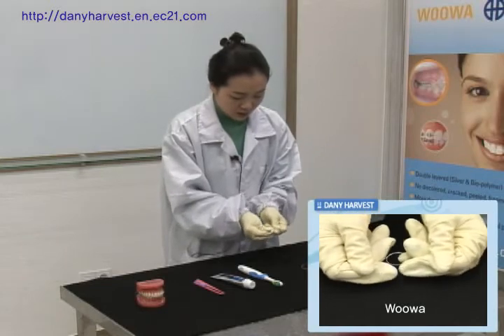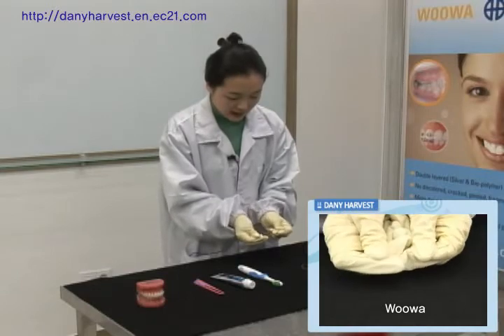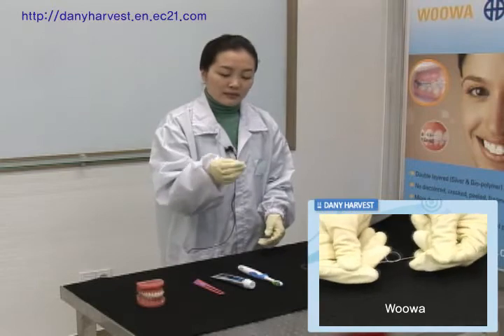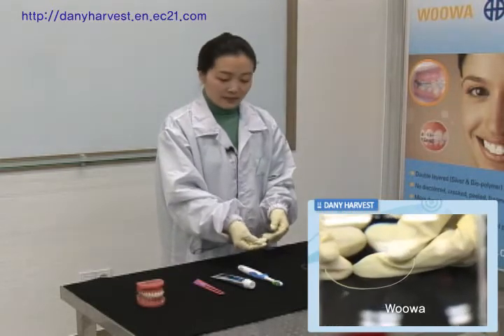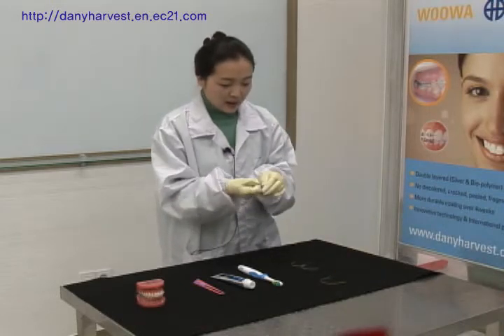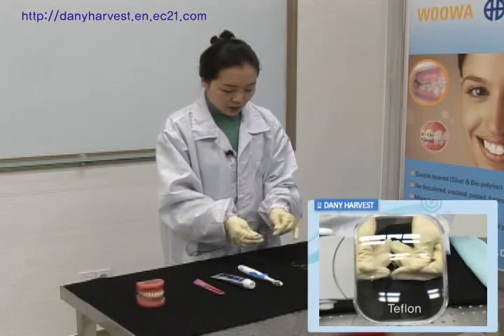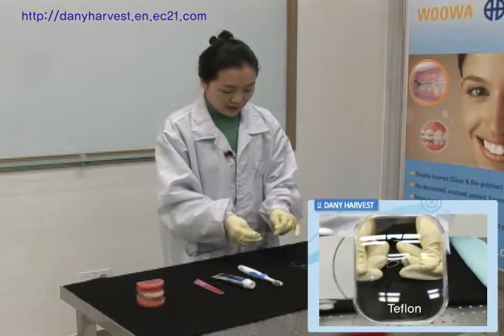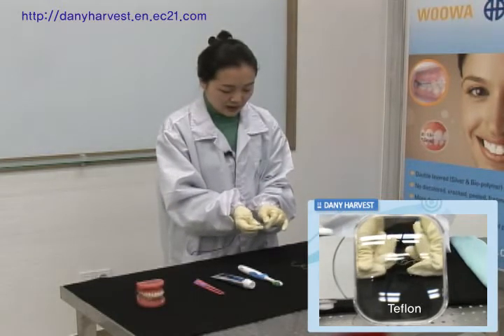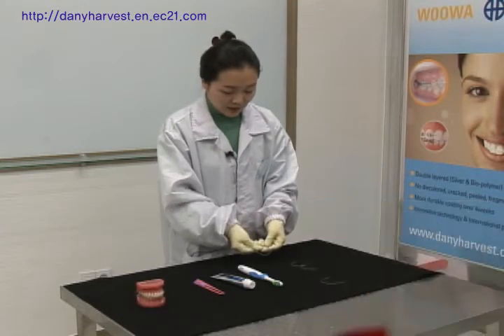I rub the UWA wire 20 times. Then I test the Teflon wire from the market, also 20 times. You can see that the Teflon wire peeled off a lot.